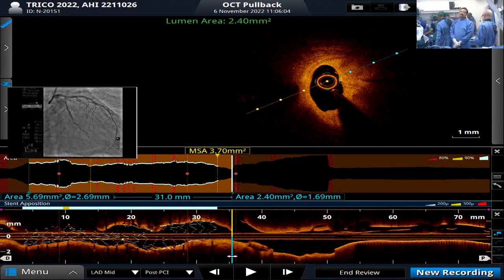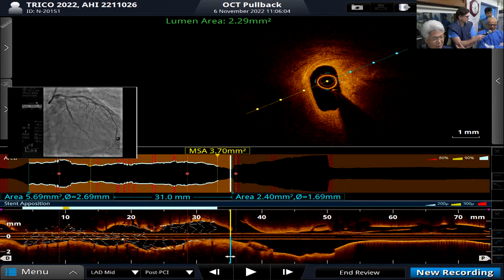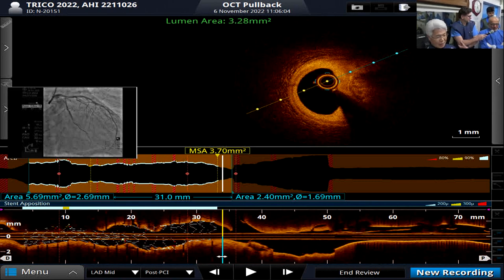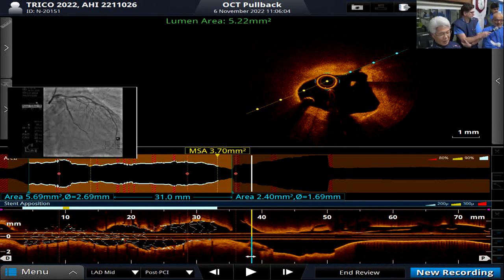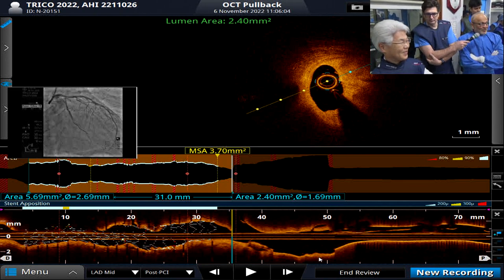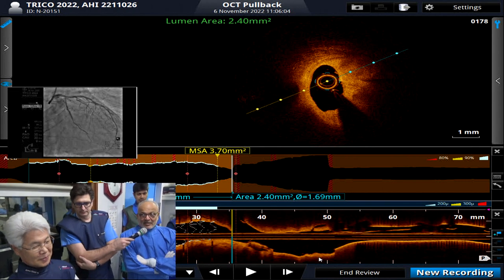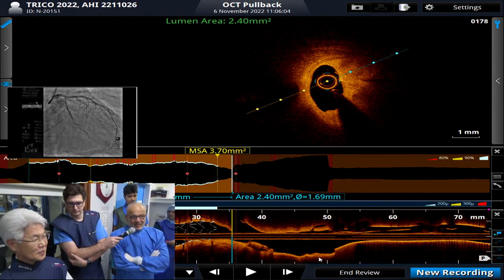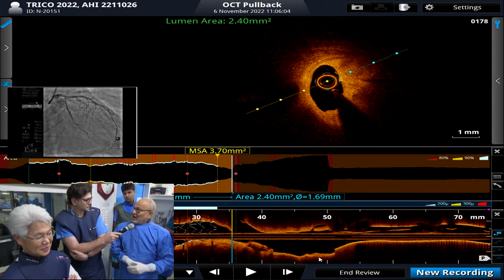without doing an FFR? Here is Dr. Patel. I think as a clinician, if I see both the images, I will treat it conservatively. And to make my case, I will endorse Dr. Saito's viewpoint to do FFR. In my practice, FFR has very limited indications, and I think this is one of them, when there is a confusion between the OCT finding and angiographic feature, and if you try to correlate clinically, these three things don't correlate, then I think it's a good idea to do FFR. Otherwise, it looks to me like a very stable plaque in the left main.